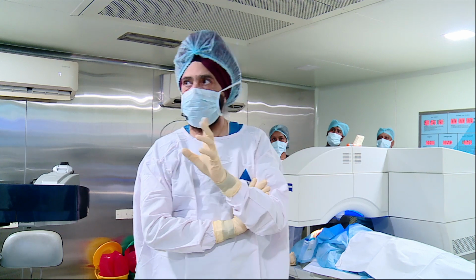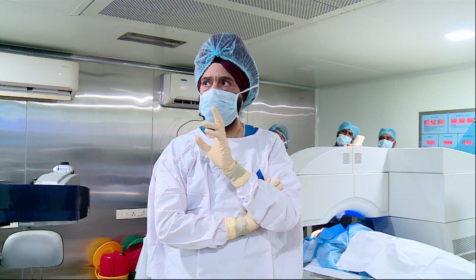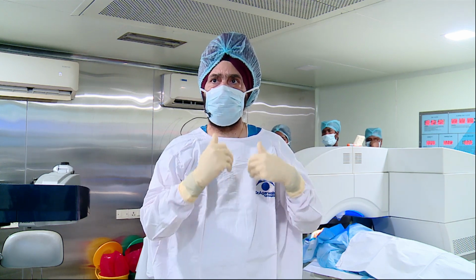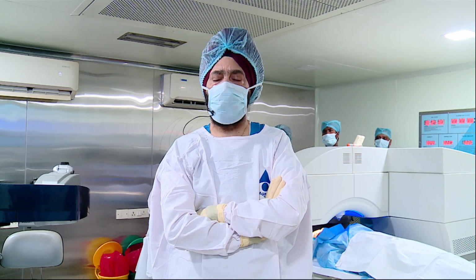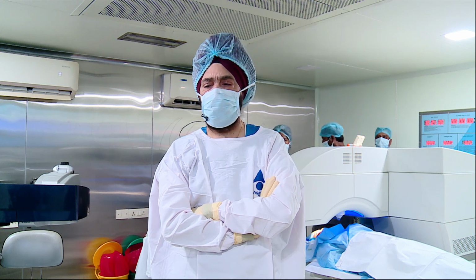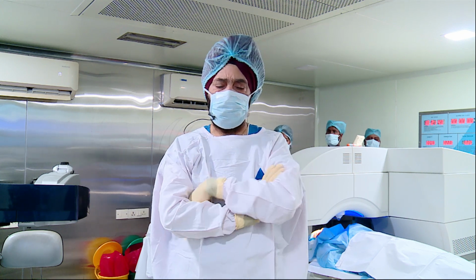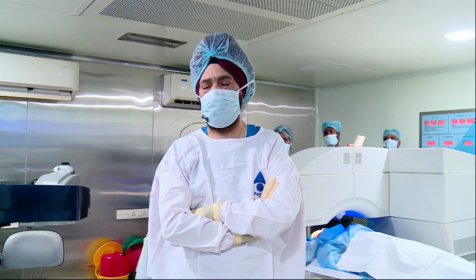Sorry, I didn't get the last part of your question, but if the question was on cyclotorsion compensation, I mark the corneas whenever the cylinder is more than 1.5 diopters, and the reticule needs to be matched on that under the microscope at that particular time, and you can turn the head of the patient to get zero torsion. Now all these machines, whether it is the Visumax 800 or the Silk machine, have the ability to do this. The IOL Master 700 with the Visumax 800 is tied to look at the cyclotorsion compensation and centration.